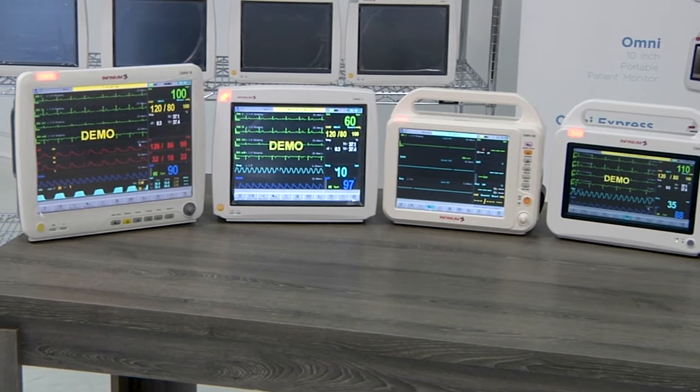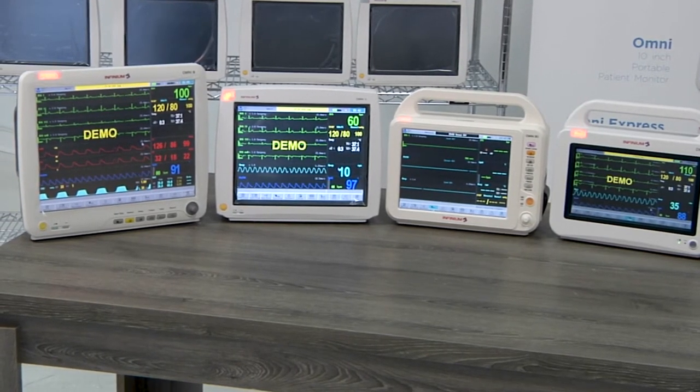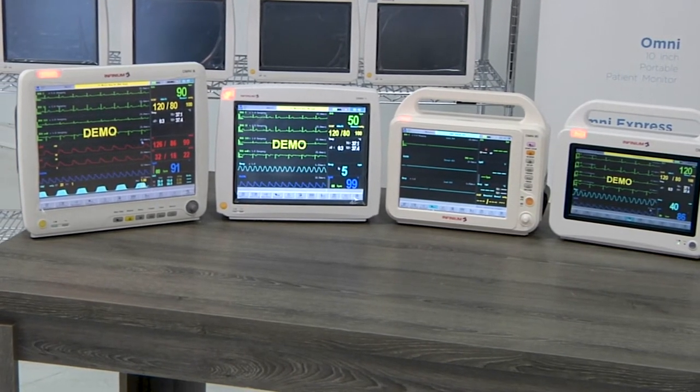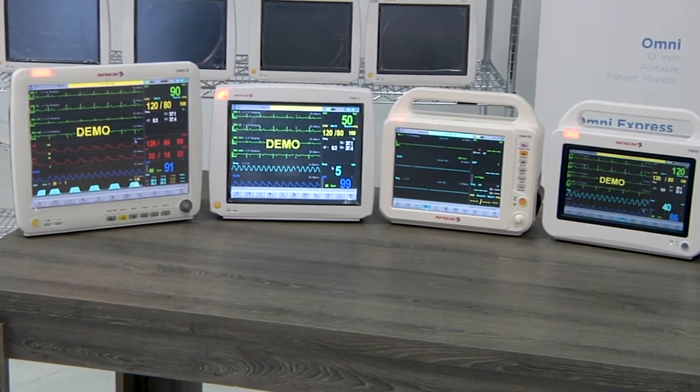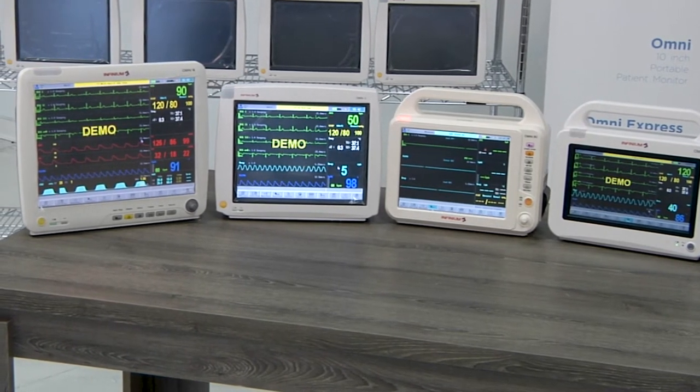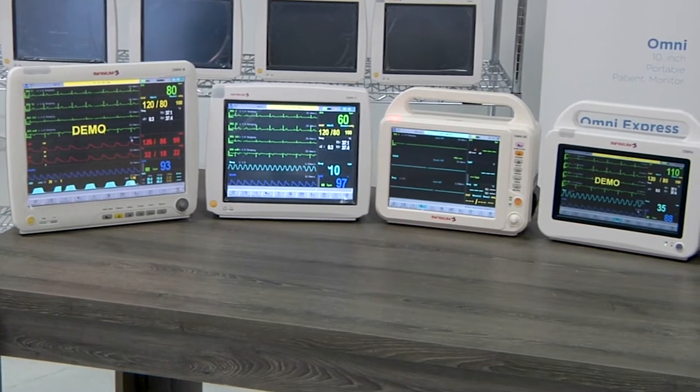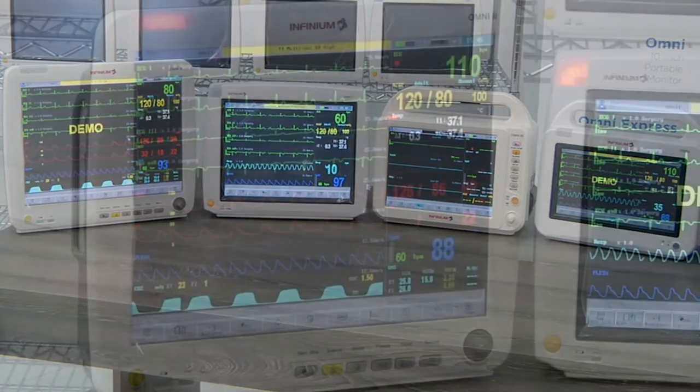Optional functions include 12 lead ECG, two channels of IBP, ETCO2, HL7, and external anesthetic gas module for anesthetic agent monitoring.